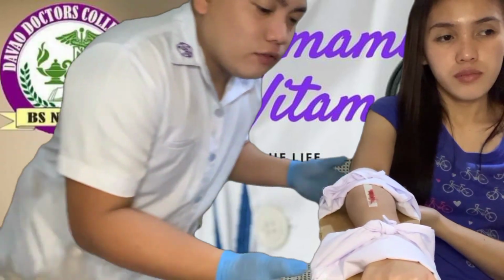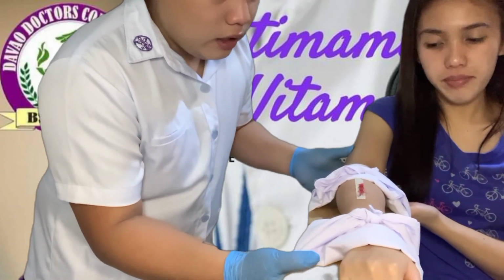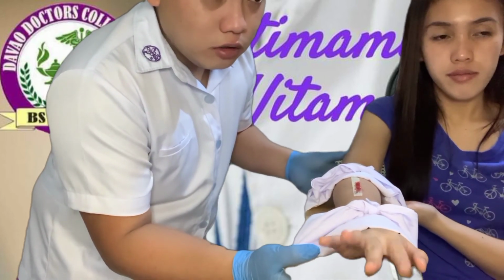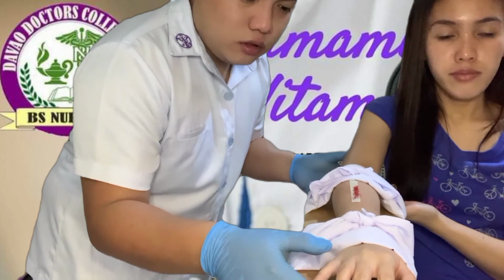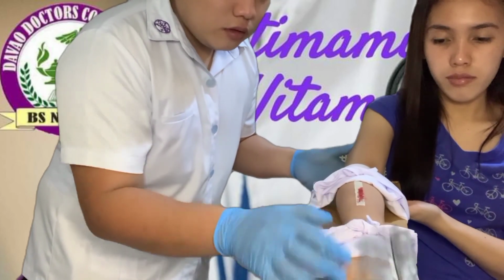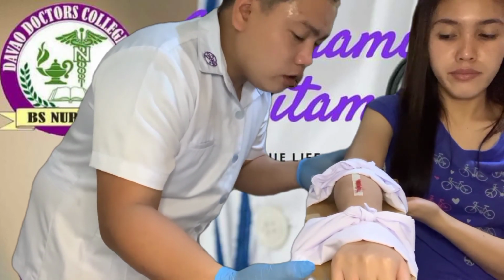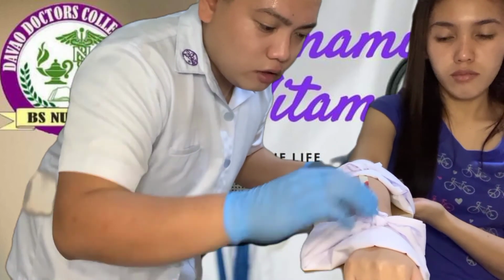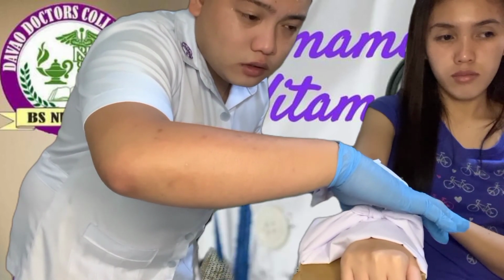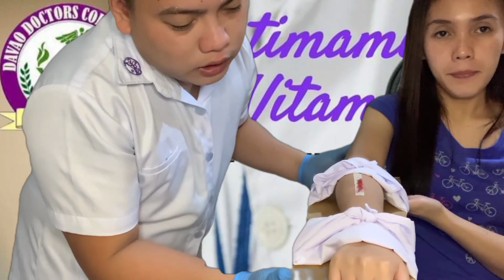So first, I'll check the feeling. So ma'am, is it good? Can you move your hand, ma'am? Your fingers. Okay. So I'll be checking also for the warmth. So I'll also be checking the color and also the pulse. Color is not pale. It's pinkish.